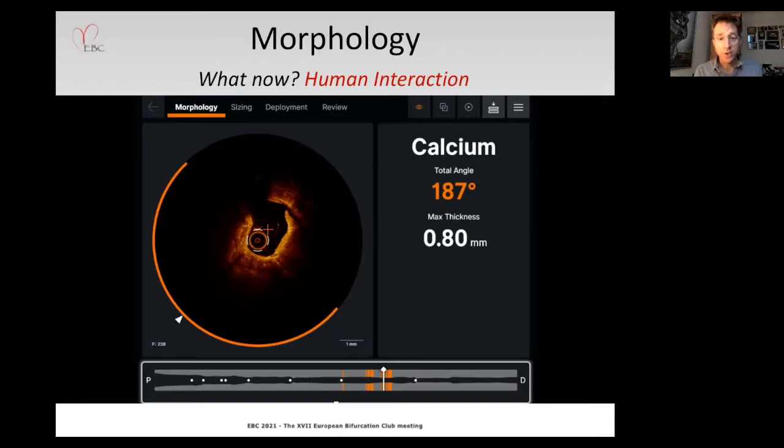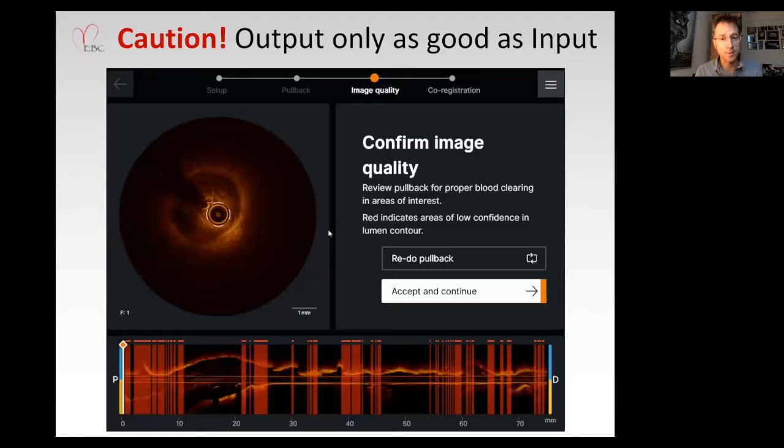And really now the question is, do you take a non-compliant balloon, a cutting balloon? Should we up and debulk with rotablation or CSI? Should we be taking IVL? And I have to say I'm not sure, and we'll hear people with very firm opinion. But the reality is machine learning and observing the decisions we make and the outcomes that we achieve may well facilitate for us a far more enhanced decision-making process.